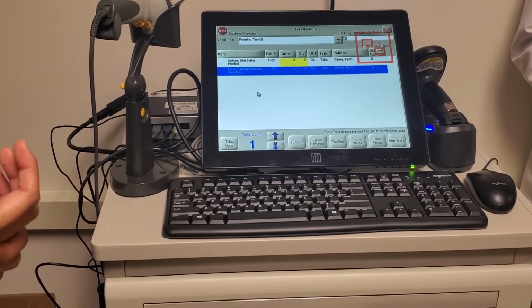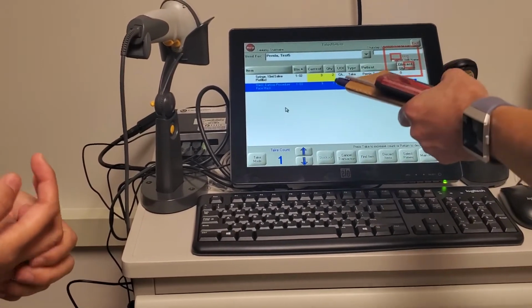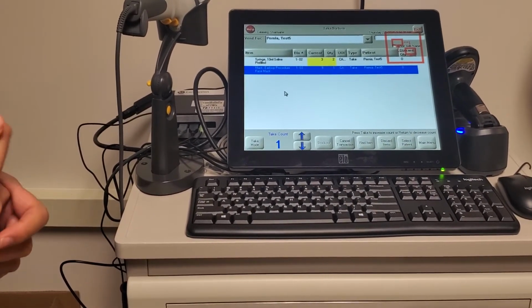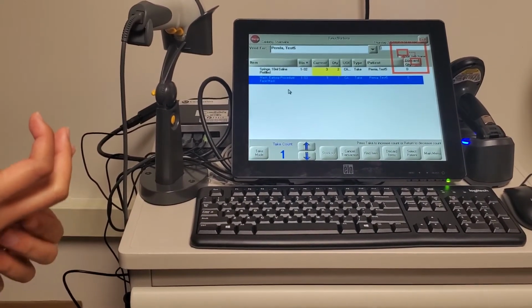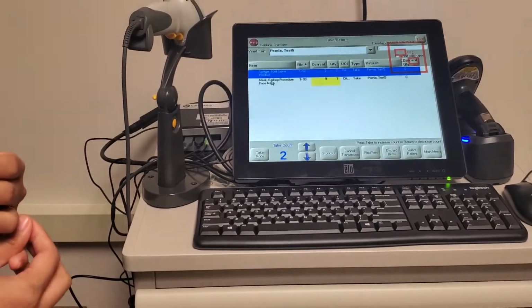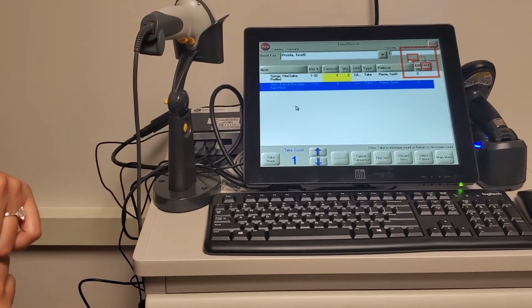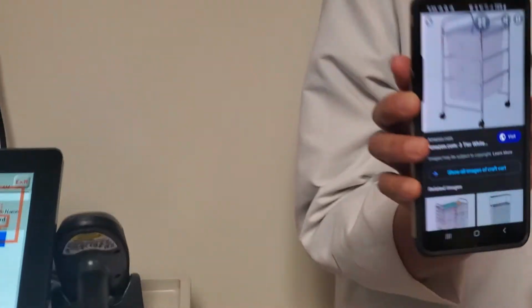That sounds better. If you're getting five flush syringes and you only use one, there's an option to return it. Did you just say flush? I don't think that's going to be returned. Sorry, I'm just being honest. Even the tape. You're right. But even if you have five supplies in your hand, when they place it inside the patient's room, they can't take it out anymore. But if they're covered like this and it's not taken out, that's exactly what I was thinking.